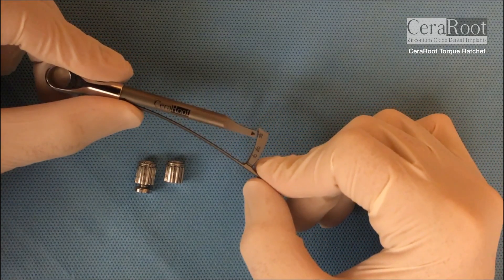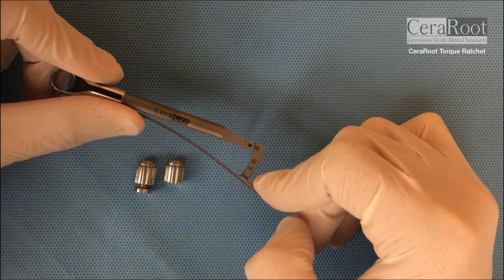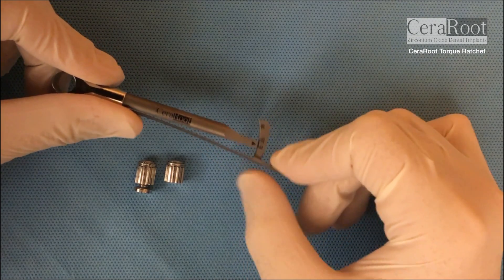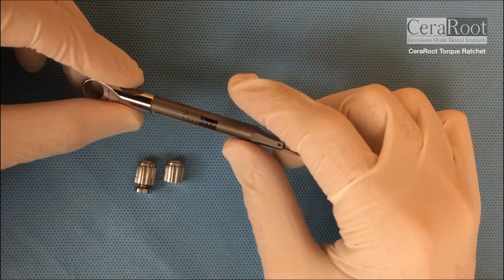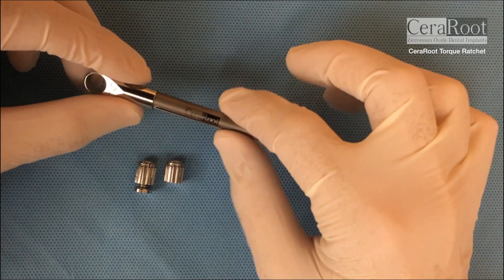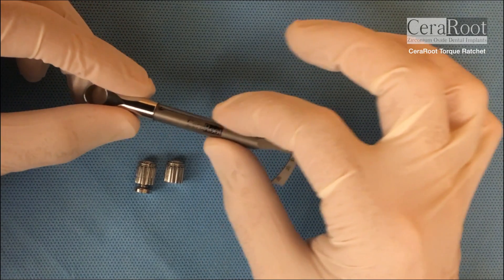In some implants, especially the narrow abutment implants, you don't want to go higher than 35 newtons, so you will use this arm. If you use molar or extra large central incisors, then at the very last turns you will be able to use the biggest arm.